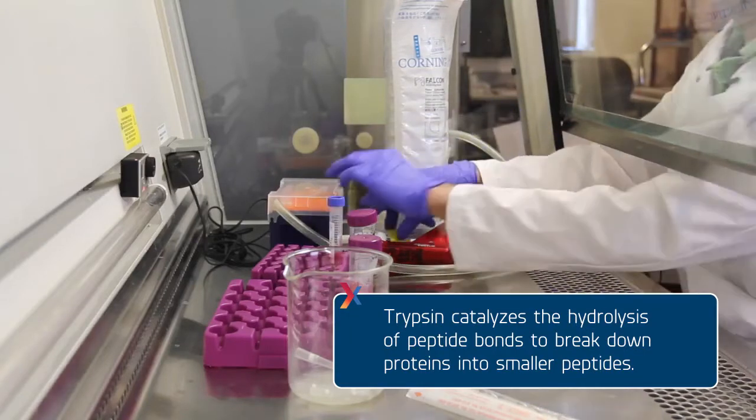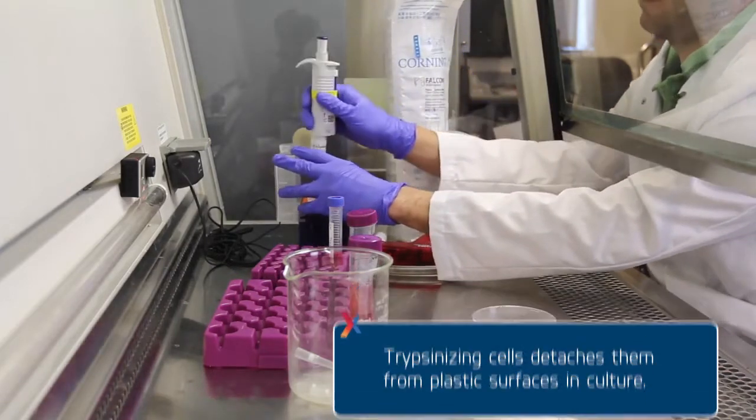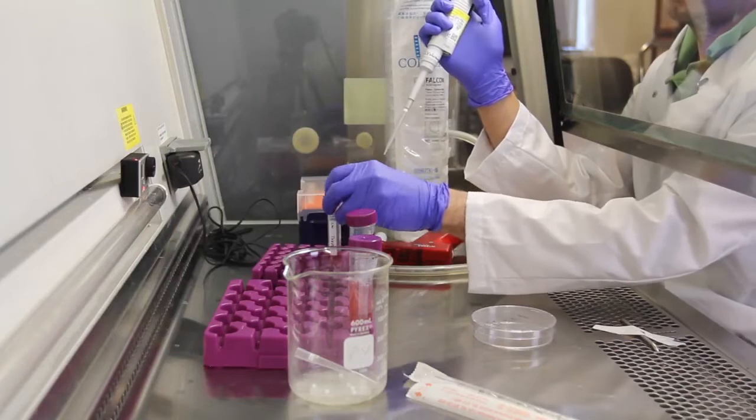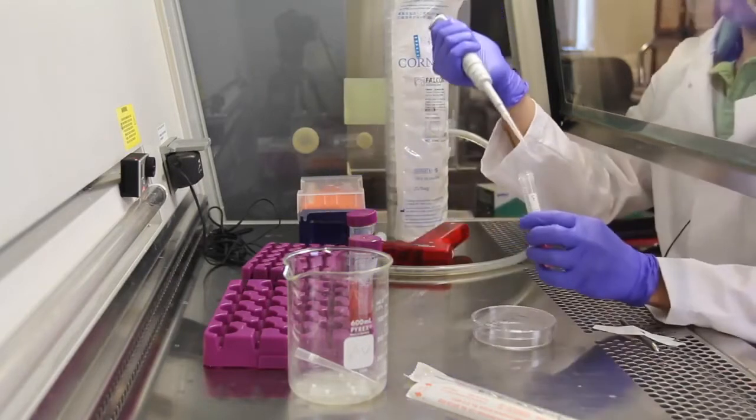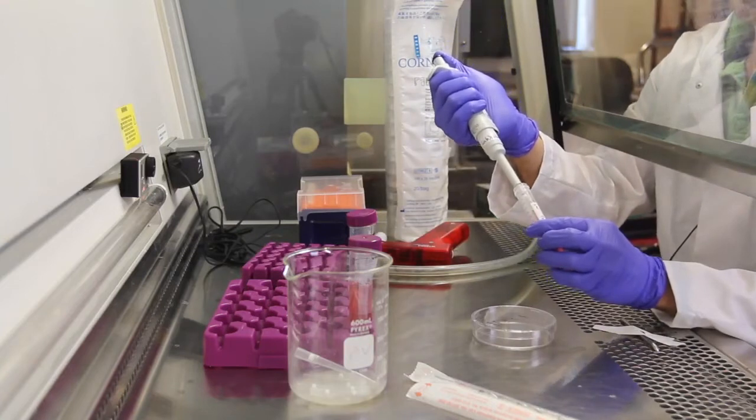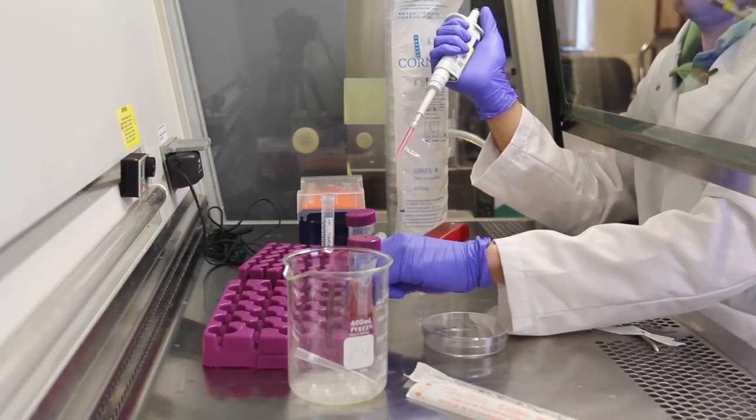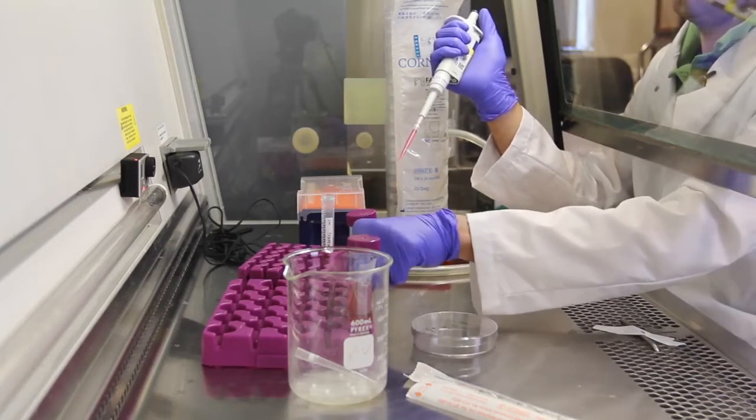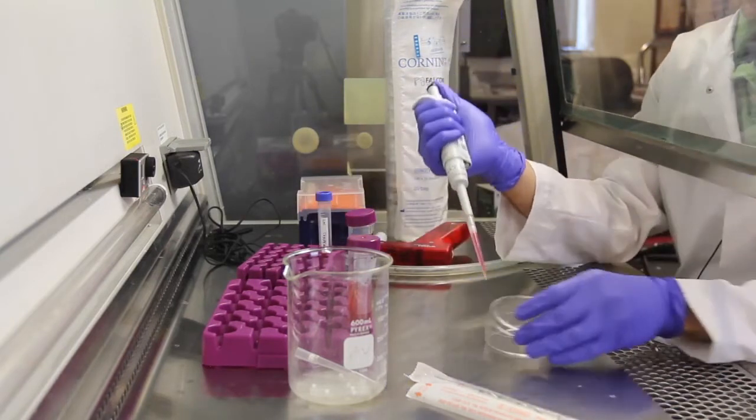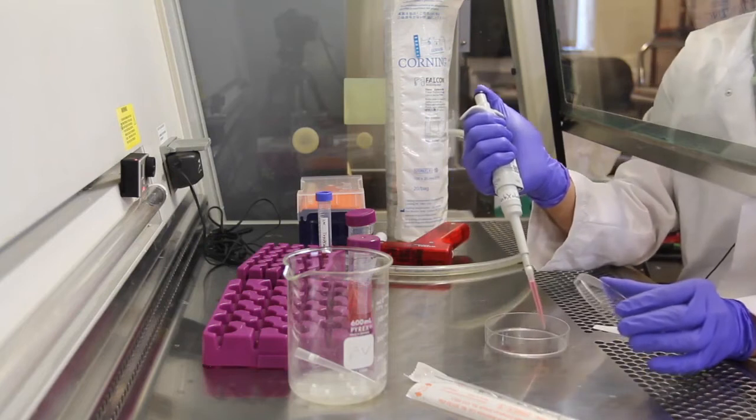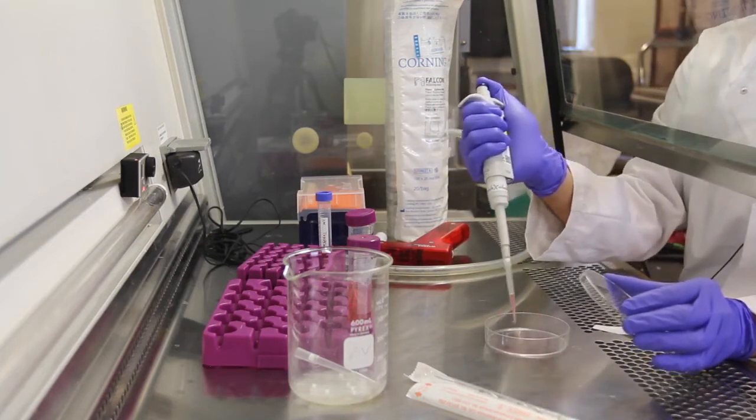Loosen the cap, take a one milliliter pipette including tip, open the cap, flip it around, and take one milliliter of trypsin. Close the tube and add the trypsin in a dropwise fashion, or close to a dropwise fashion, to make sure it gets good coverage on the entire plate.